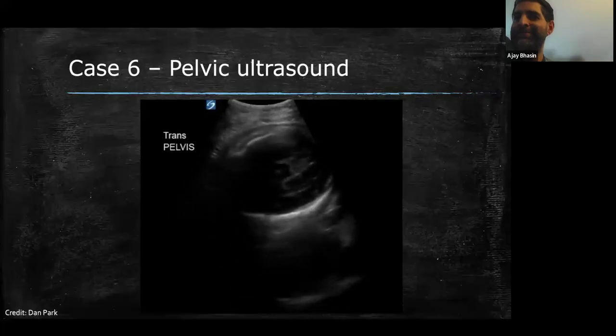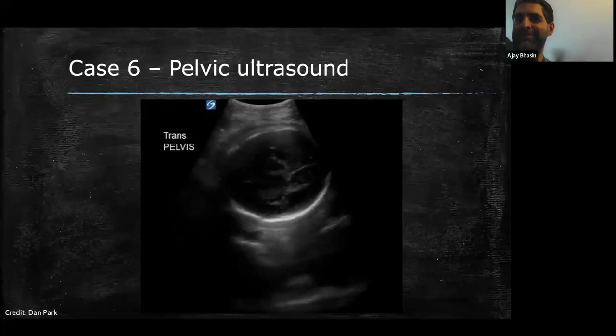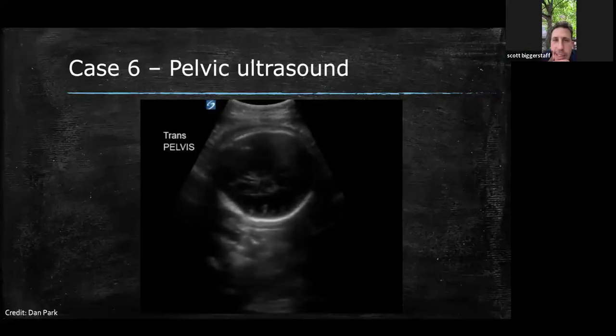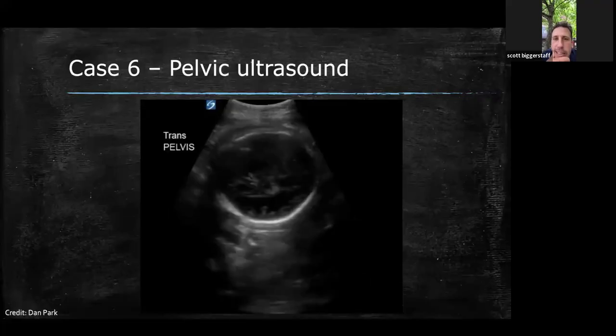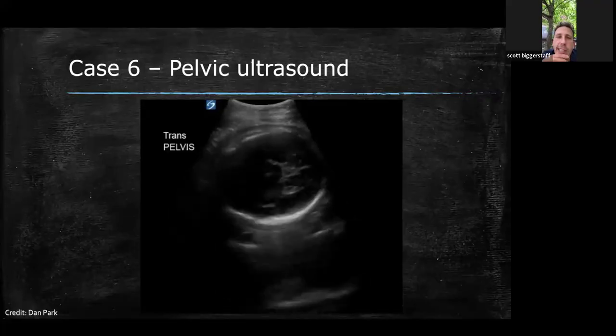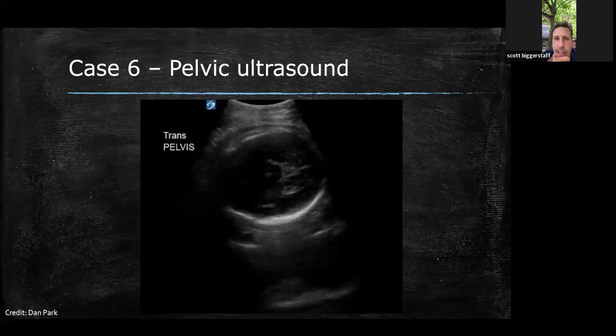So if it is a bladder, it looks really round. And then almost looks like septa inside of it. Like there's different echogenicities. I see posterior acoustic enhancement on the back wall. So it looks like a fluid filled structure. So I don't know if that's like a giant abscess, or if it's in the bladder and there's weird stuff collected in there, like sediment or something.